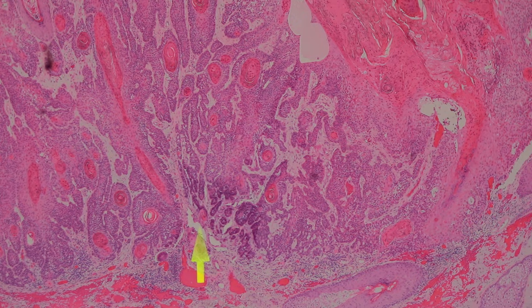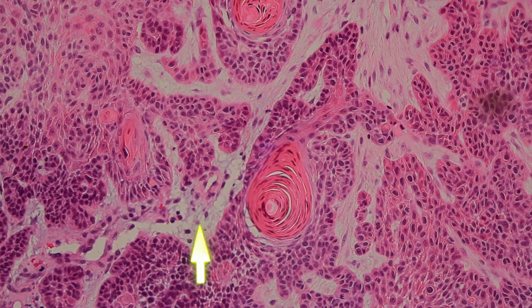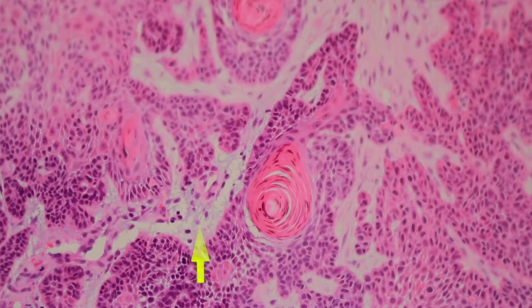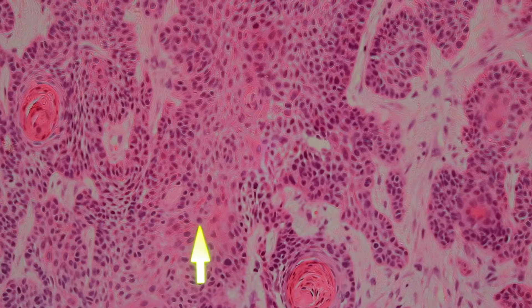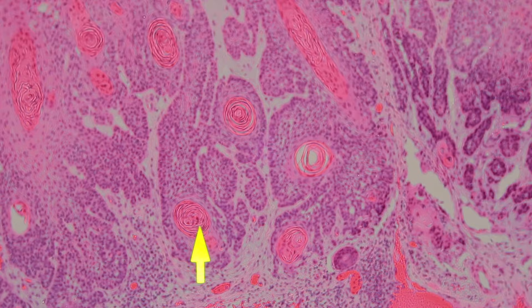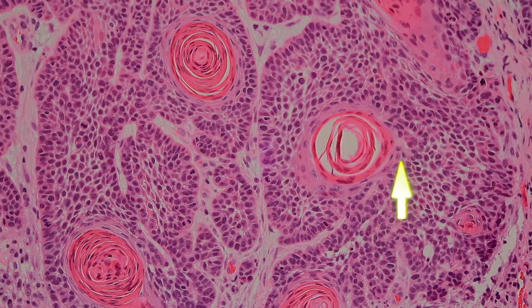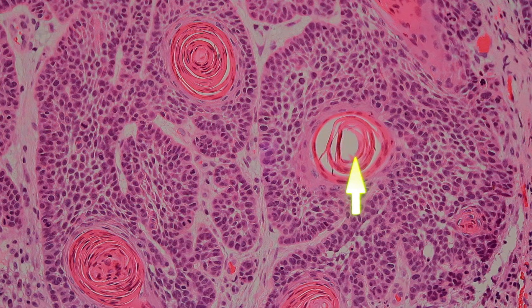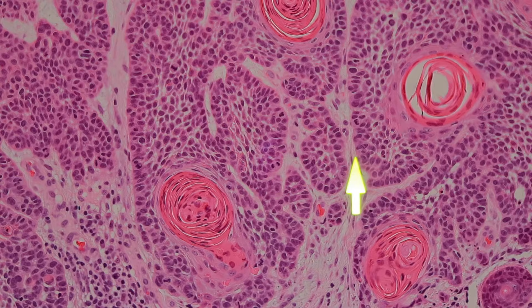Even though it's sitting up high in the skin, there still are little islands of invasion. And again, they have that very nice swirly look. Parakeratosis is a dense keratin; sometimes flipping your condenser back and forth on your microscope can give you a better view of the individual cracks between the swirls. Sometimes the center will fall out during cutting and give you a central cystic space — a hole — that makes it look kind of more loose, like a horn pseudocyst. So keratin pearls can sometimes start looking a little more loose, but most of the time you can sort them out with a little practice.